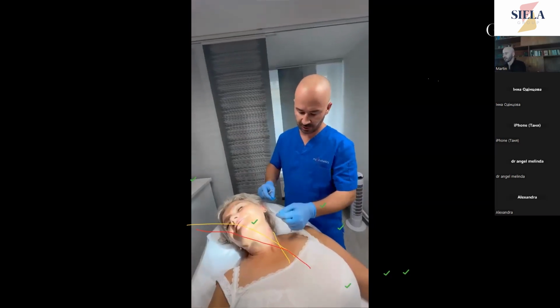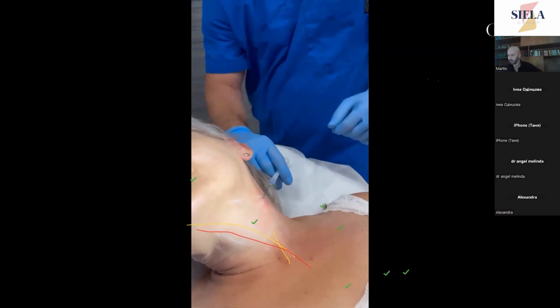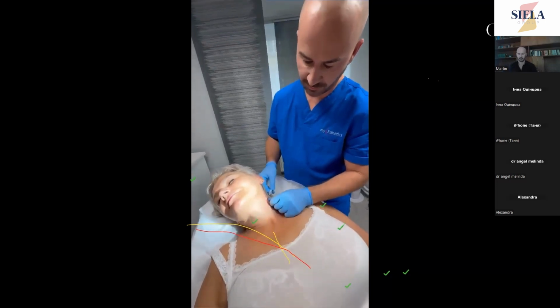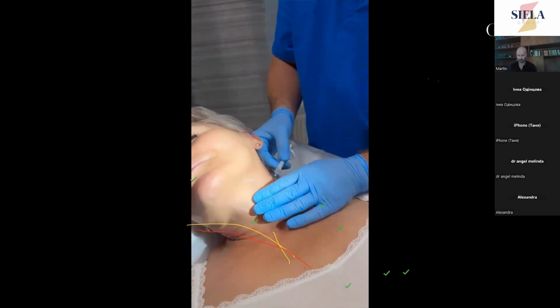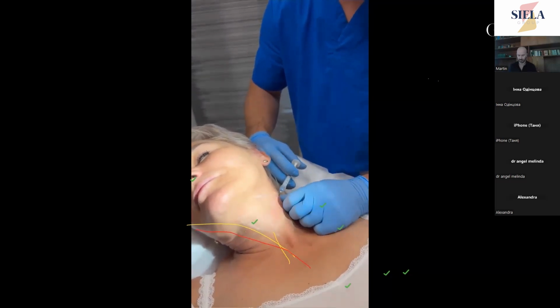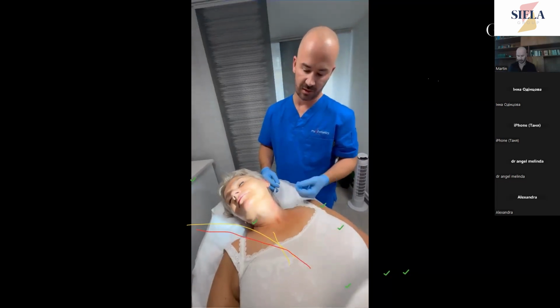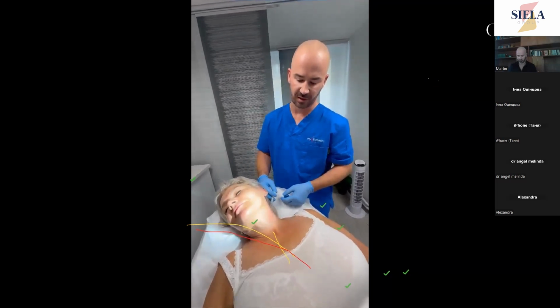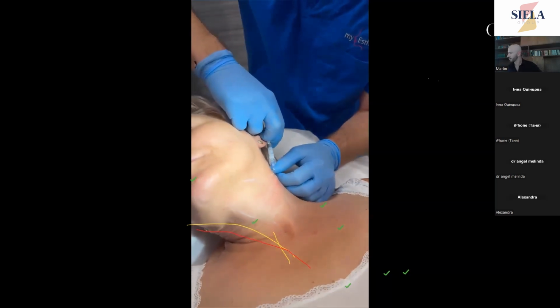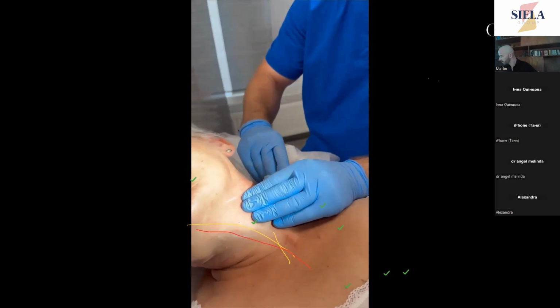So on the left side is our second entry point. Again, we're going to use Easy Guide. It's very simple to get inside, and we're going to continue with our first horizontal vector as on the right side before, leading your cannula somewhere near to the midline, and then with retrograde application. And then the procedure is the same in your second and third vector. Last vector and last retro.